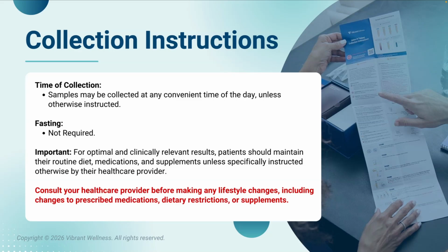As for timing and pretest conditions, blood samples may be collected at any convenient time of day, unless otherwise instructed. Fasting is not required. However, for optimal and clinically relevant results, patients should maintain their normal routine, medications, and supplements unless specifically instructed otherwise by their healthcare provider. As with all testing, patients should consult with their healthcare provider before making any lifestyle changes, including changes to prescribed medications, dietary restrictions, or supplements.